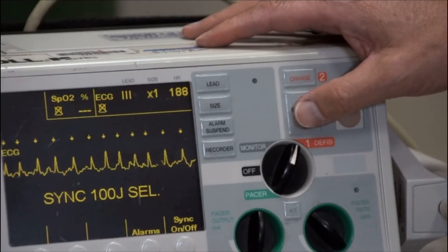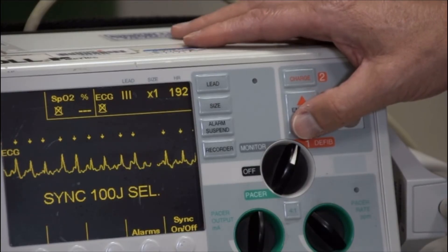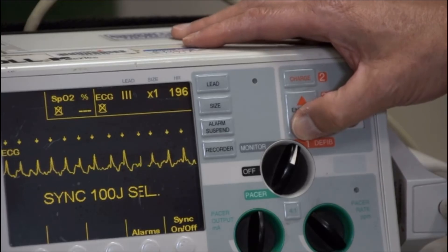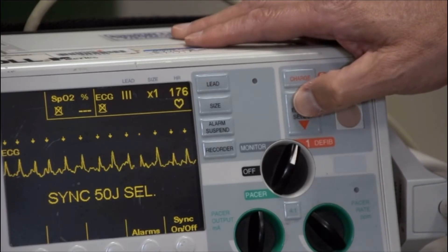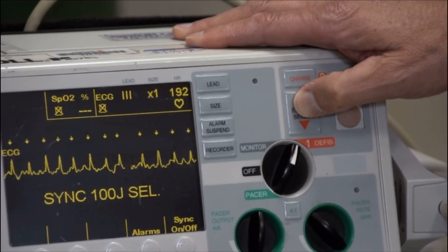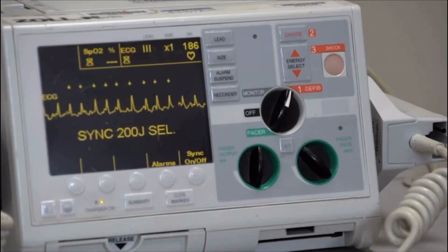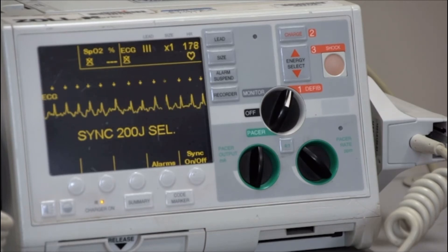Select the desired energy level. Recommendations vary, but usually for a biphasic machine, start at about 100 to 120 joules for atrial fibrillation, 50 joules for other supraventricular tachycardia, and 100 joules for monomorphic ventricular tachycardia. For a monophasic machine, select 200 joules for atrial fibrillation and 100 joules for other supraventricular tachycardia or for monomorphic ventricular tachycardia.